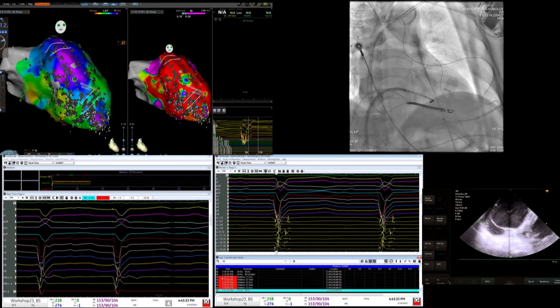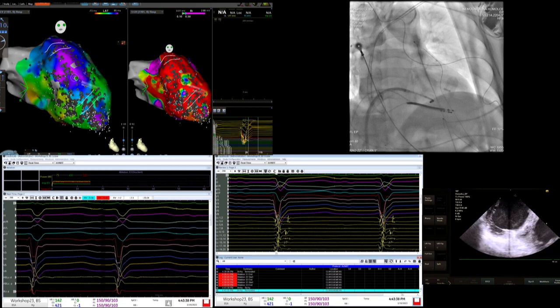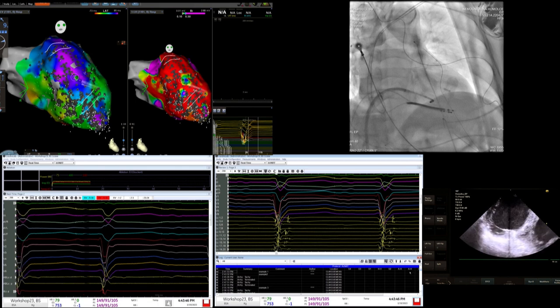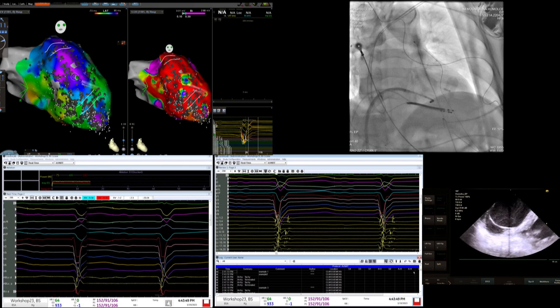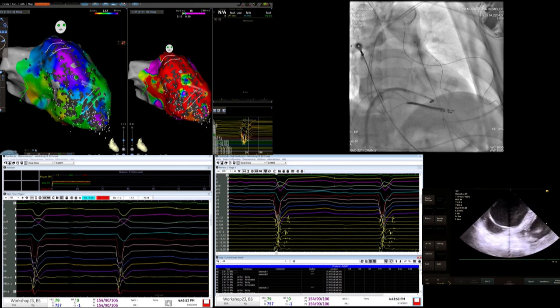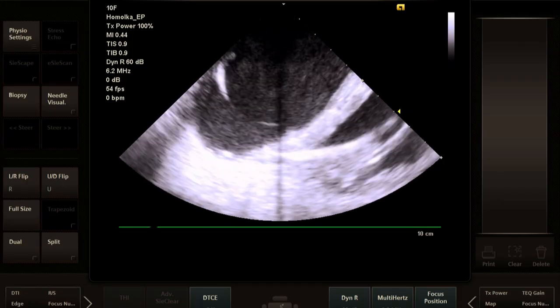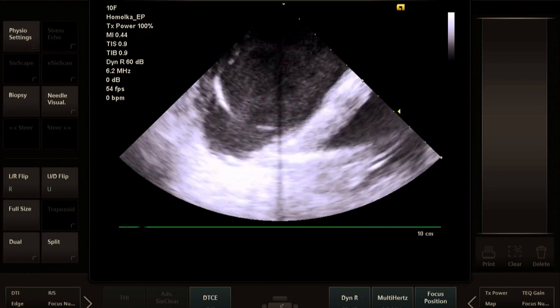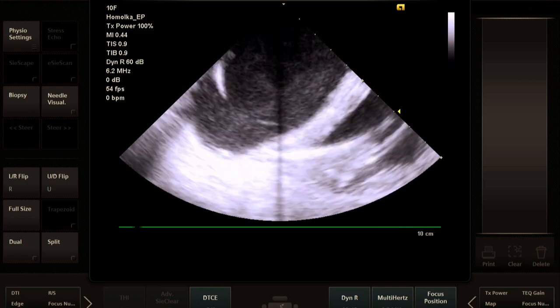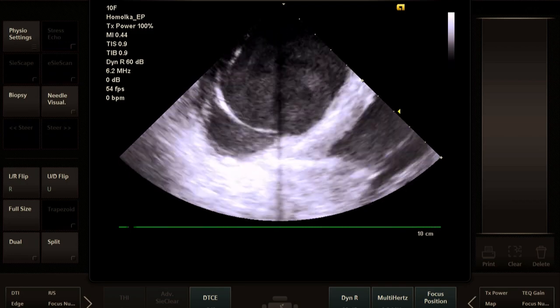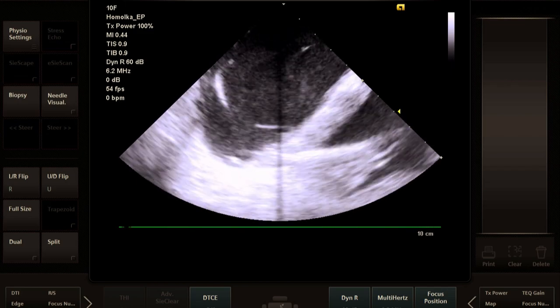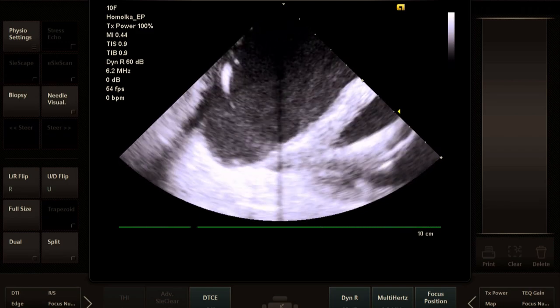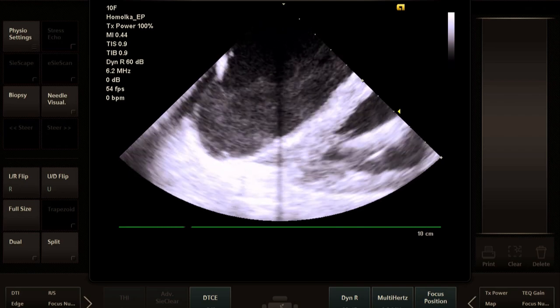This is an 80-year-old patient with a large anterior infarction who came with VT storm, EF around 15-20%. On ICE you can see the left ventricle - looking at the septum, there's a hyperechogenic area just deeper than the endocardium in the subendocardium, with the RV deeper. This area is very thin. There's also smoke visible, no clot - running with a fairly high ACT.